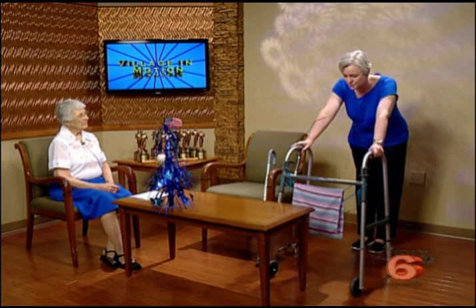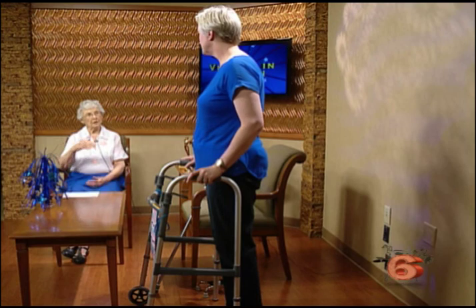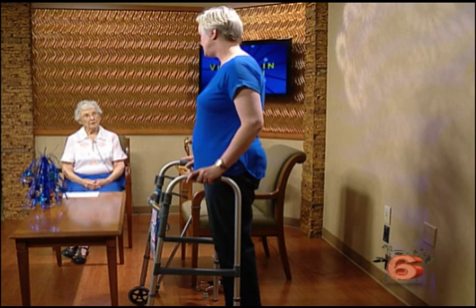And that goes for the rollators too. I know a lot of the residents have the rollators with the 4 wheels and the seat. Those are great, love them. The same principle goes with that as far as the height and also positioning. I see, again, a lot of people tend to have this slouched over posture and tend to push the walker or the rollator too far away from them. Especially with rollators, because they have 4 wheels instead of 2, they tend to go faster, so you really want to try to have those closer to you. Well, and also with that little seat in there, it keeps them from getting up close to the walker. That is true.